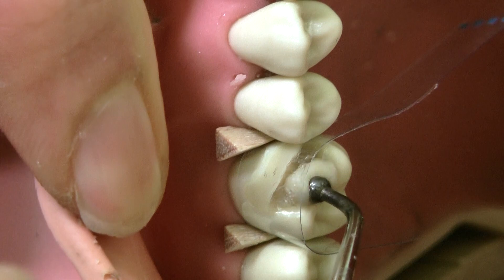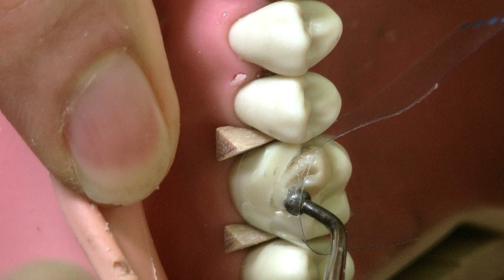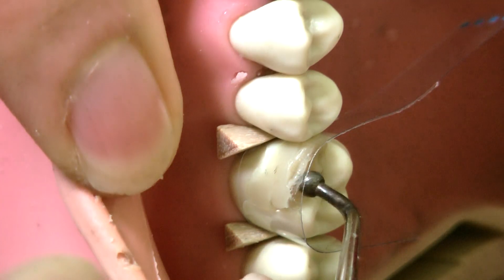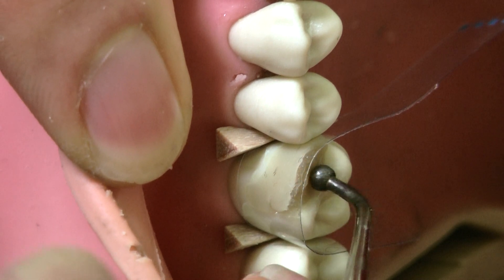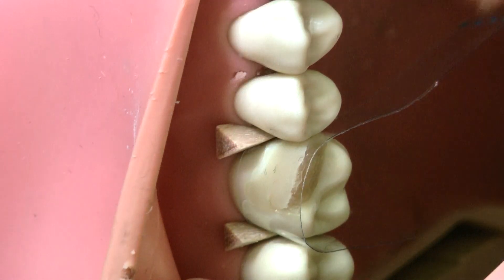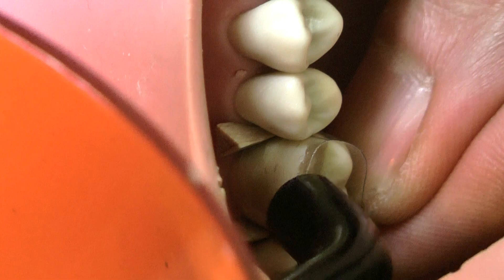Now adding the second increment of composite — again pack it nicely over the tooth wherever you need it. Just before we cure it, we wrap the mesial side of the mylar strip around the tooth again and cure it for another 20 seconds.